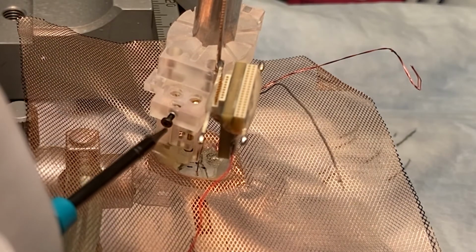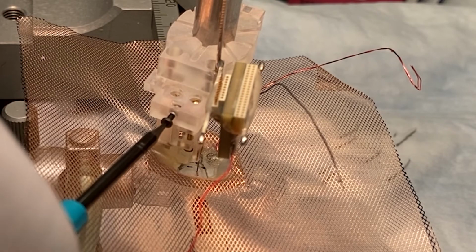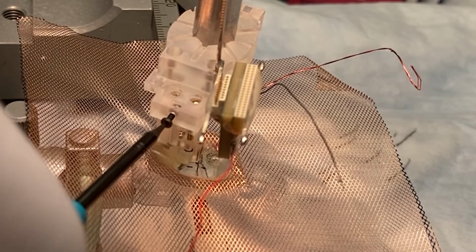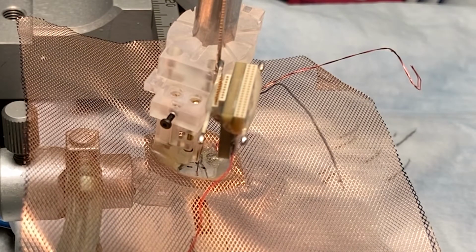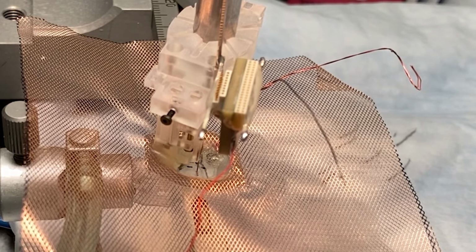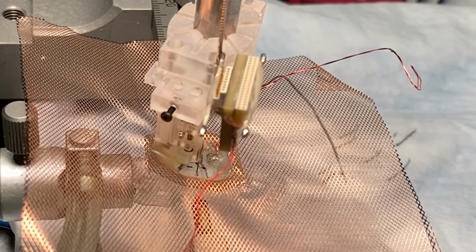And then we can release the side screw from our stereotactic attachment, and then we can start moving it away from the drive. So now this screw is released, and then we can start moving away a little bit. During these steps, you need to be extremely careful to always pay attention to the flexible cable, because you don't want to put tension on the flexible cable at all.